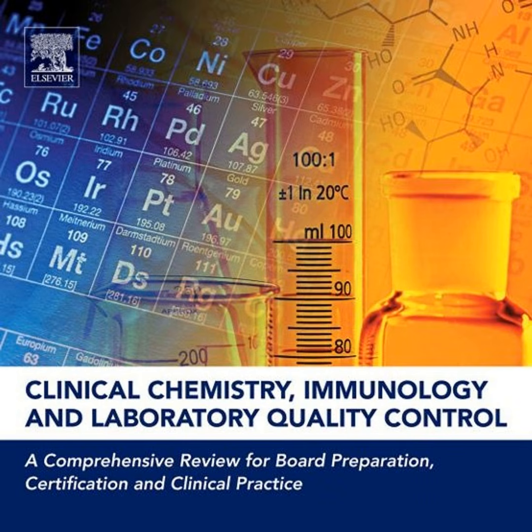And using the wrong tube itself can just totally skew results. You mentioned lithium. Yes. If you collect a specimen for lithium level in a tube that contains lithium heparin as the anticoagulant, which is a common green top tube, you are literally adding lithium to the sample. Leading to a falsely elevated, dangerous result. Directly. Another variable is patient prep. Glucose testing and lipid panels, they absolutely require the patient to fast overnight.